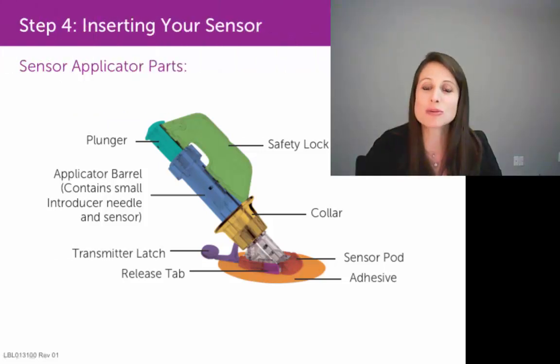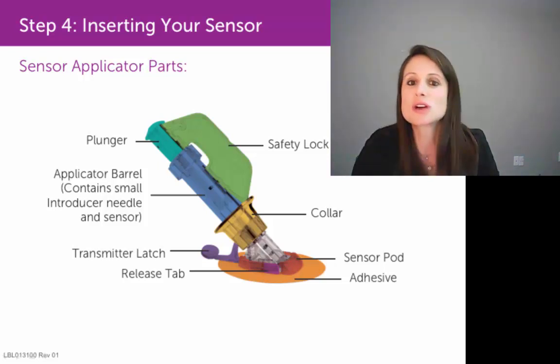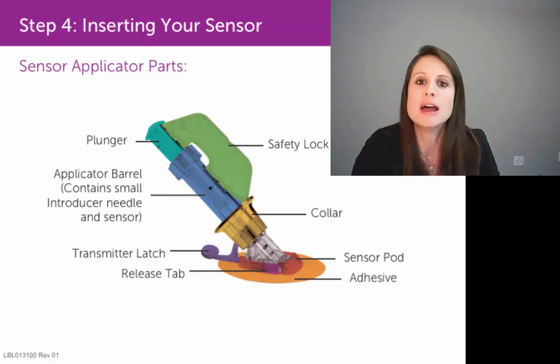Now I'm going to demonstrate how to perform that sensor insertion. Once you've found a good spot on your skin, make sure you thoroughly clean it off with an alcohol pad and scrub your skin pretty well to remove any dead skin cells or oils that could interfere with that sensor from sticking.